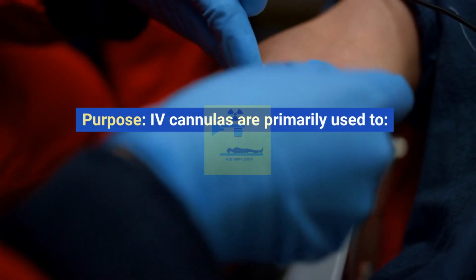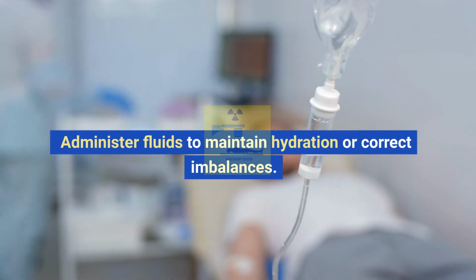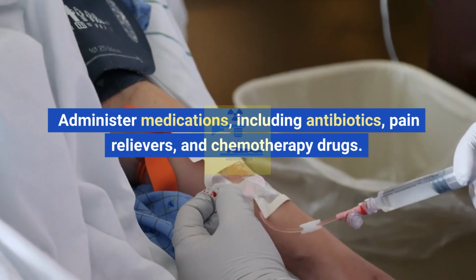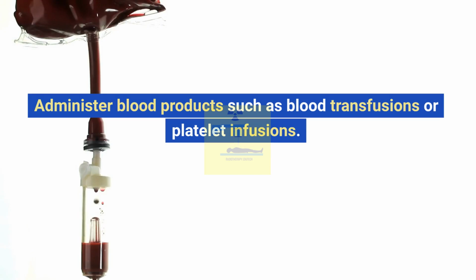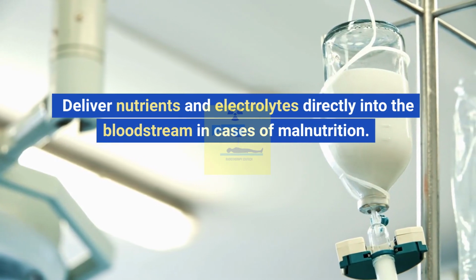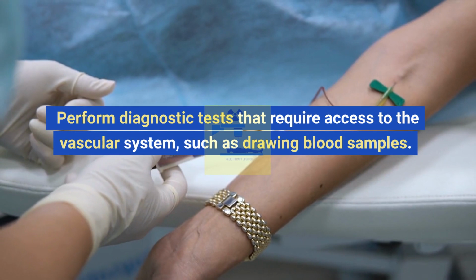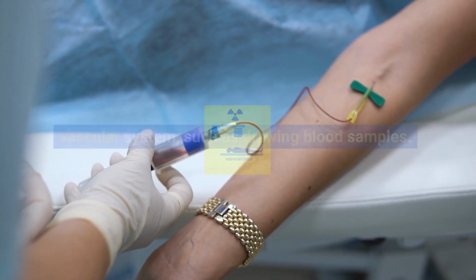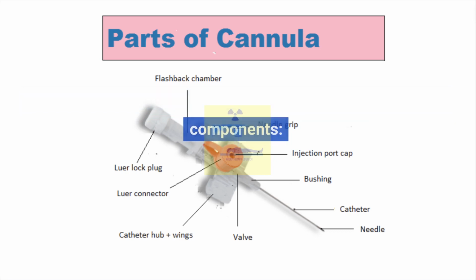Purpose: IV cannulas are primarily used to administer fluids to maintain hydration or correct imbalances, administer medications, including antibiotics, pain relievers, and chemotherapy drugs, administer blood products such as blood transfusions or platelet infusions, deliver nutrients and electrolytes directly into the bloodstream in cases of malnutrition, and perform diagnostic tests that require access to the vascular system, such as drawing blood samples. Components: IV cannulas typically consist of the following components.